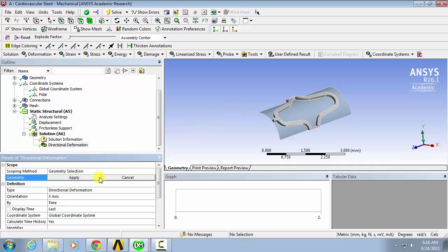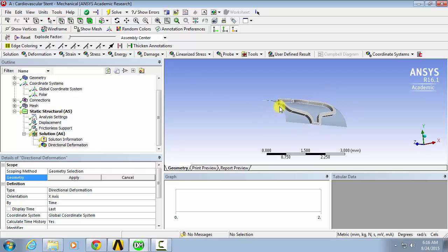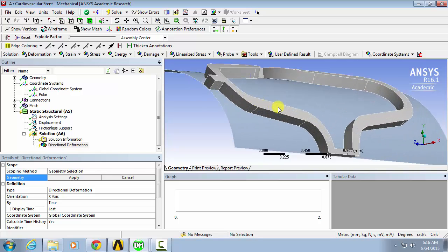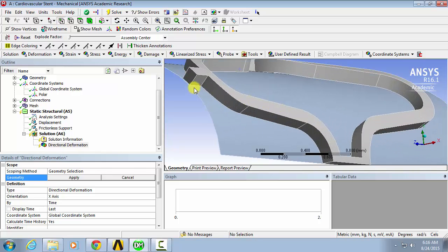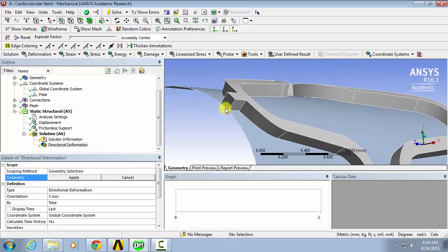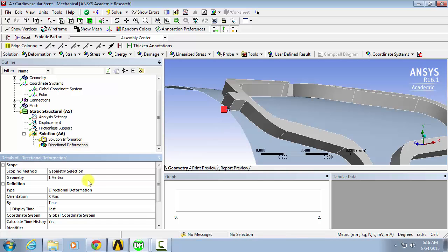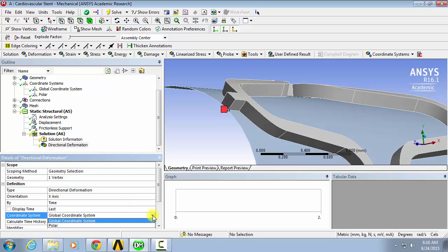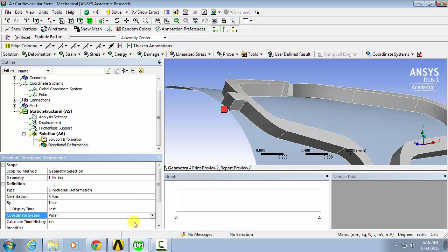Under geometry, we'll go to point selector and select either this vertex or this vertex on the stent. Apply, and then orientation is x-axis and polar coordinate system. So now we're reading the deformation along the radial direction.